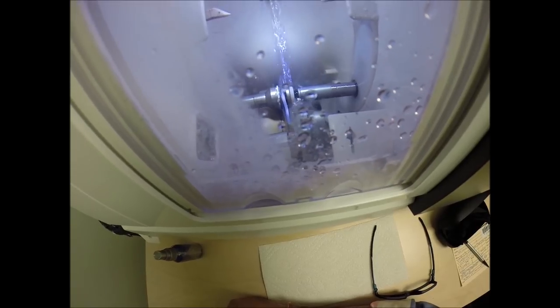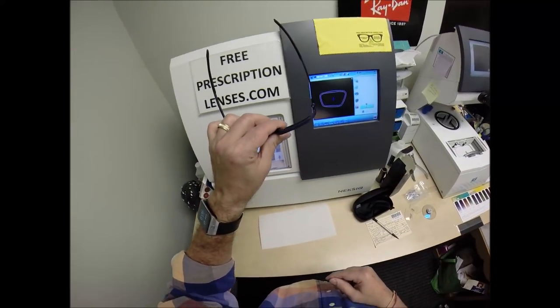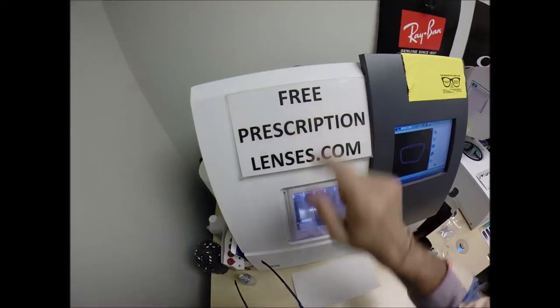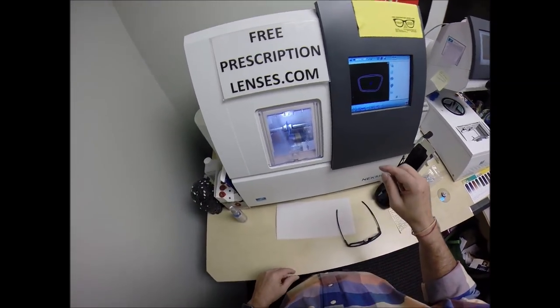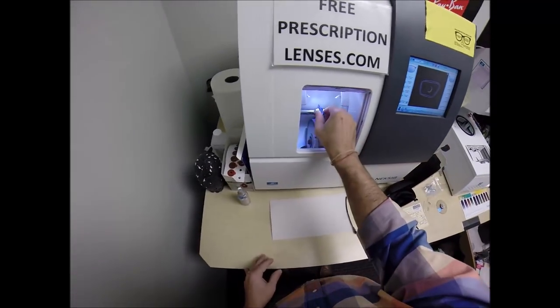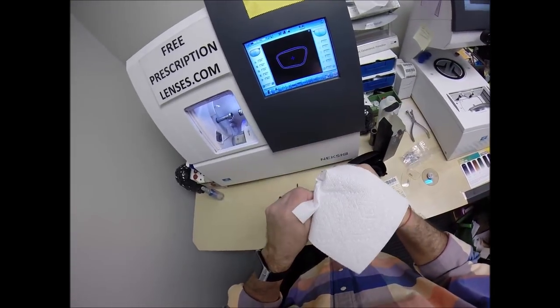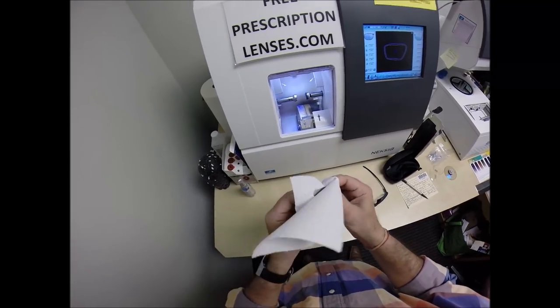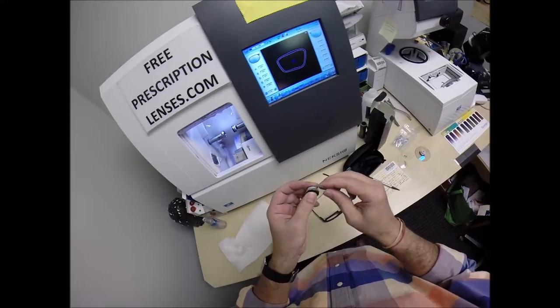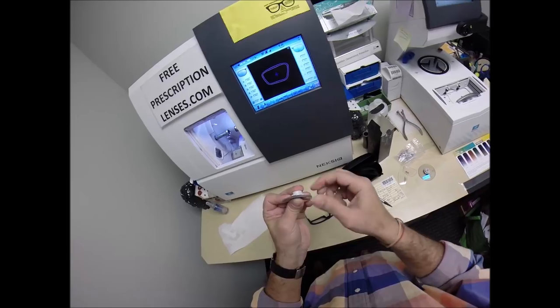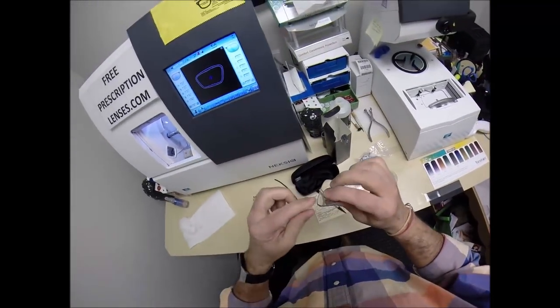The little lever is going to come into view. At the end of that is a spinning disc that's going to apply the safety bevel, which is just going to smooth out the back surface of the lens. I cut some stronger prescriptions all day long for free when you buy a frame from me.